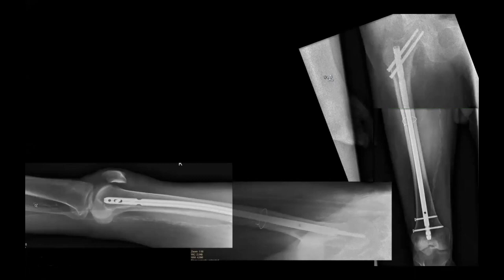You've not done anything to jeopardize the blood flow to this bone, certainly not anything more than the fracture has done to it. Now you have it perfectly aligned. It can load share. This patient can weight bear immediately. There's no muscle in there. And so everything you've done here is promoted healing and early ambulation in this patient. Yeah.